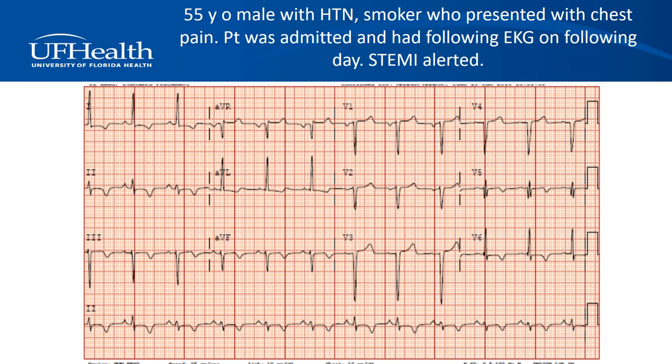Case 12. A 55-year-old male with a past medical history of hypertension and smoking who presented with chest pain. The patient was admitted and had the following EKG the next day and was STEMI alerted at that time. Please pause the video at this point to review the EKG.